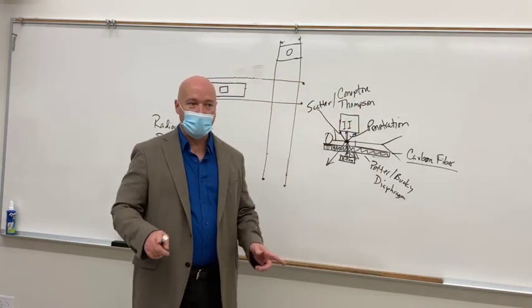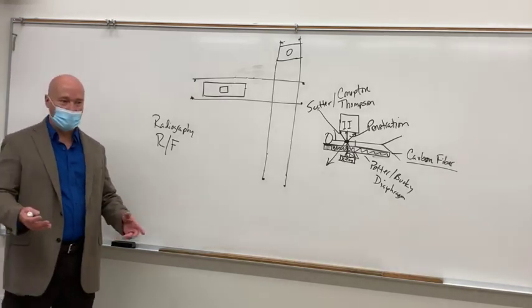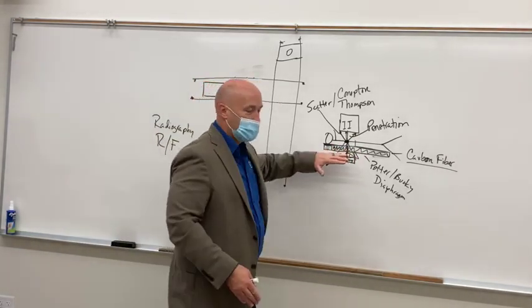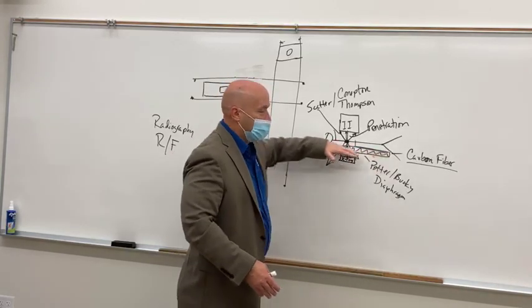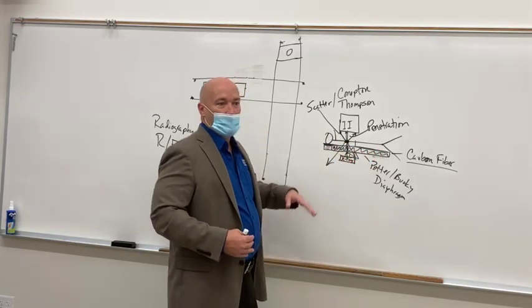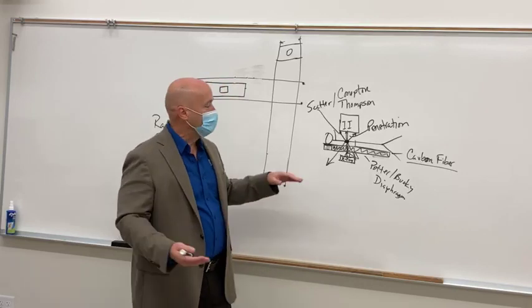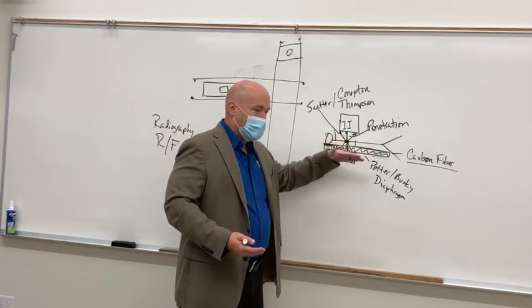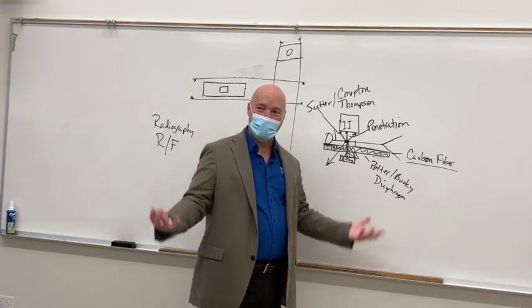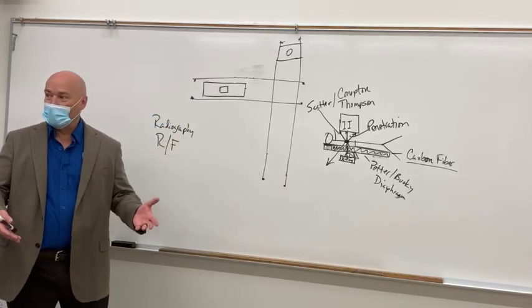Some of your rooms don't have that. Most of your more modern rooms do, but some of your older rooms don't. What they've got is this thing that if you flip it down, you can see the bucky, but this whole area down through here is wide open. There's nothing there, okay? You can actually look inside of that hole. That's what we call a bucky slot. You can look inside that big hole and you can see the x-ray tube down in there, and you can see all the barium that's leaked off of the table down into it, it's just nasty. But you can see it.